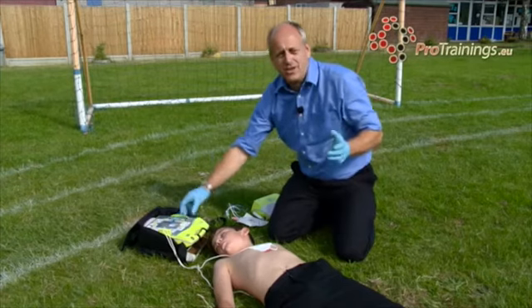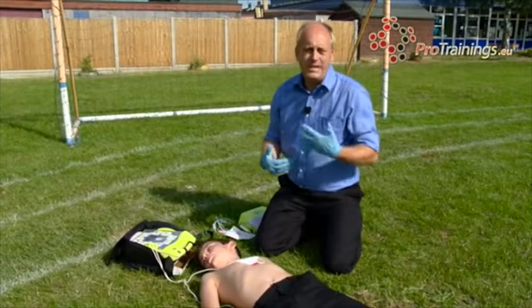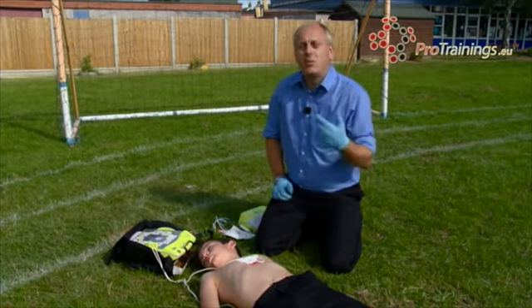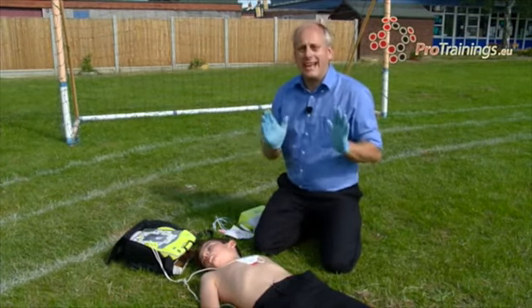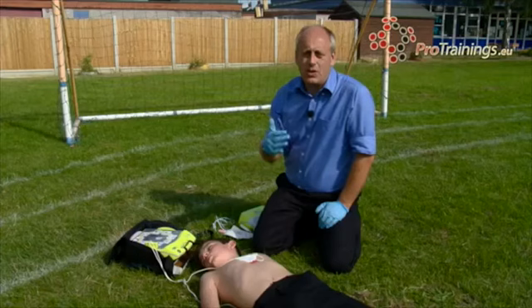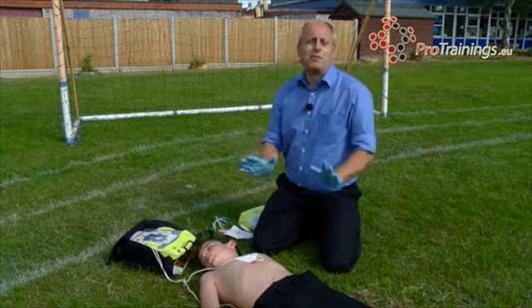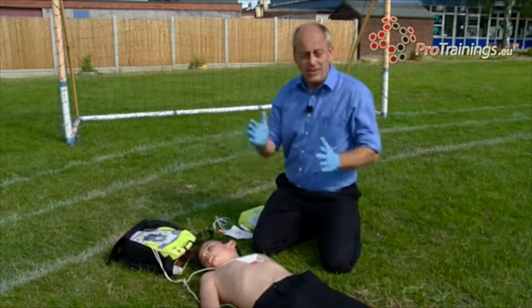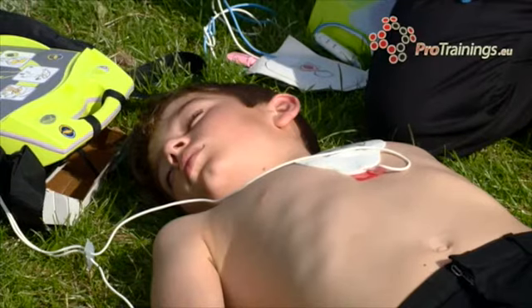Once you've delivered the shock, the unit will tell you what to do next. And the way these units are configured, it will tell you to continue CPR. So you'll then do another 2 minutes of CPR, and then it will come into an analyzing cycle again and analyze the heartbeat. At that point, it will tell you, do not touch patient, analyzing. And if it is a shockable rhythm, it will tell you to deliver another shock. Or it might now say, no shock advised. That doesn't necessarily mean that you're wasting your time and it's all over, because no shock advised, remember, can mean the child has got a normal heart rhythm, or it's just a non-shockable rhythm. And for that, we need the paramedics to come in and do their thing to actually revive the child.